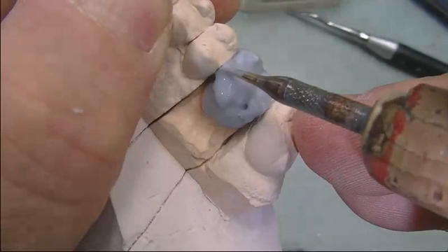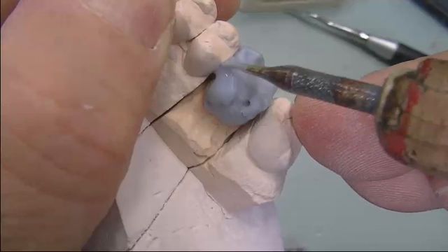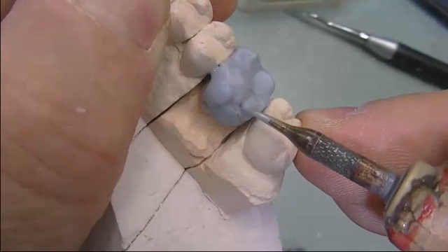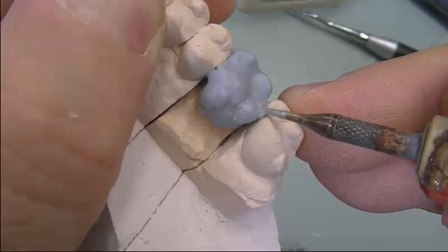Continue to fill in. Now we are filling in on the lingual surface, filling in the proximal area. As mentioned, it is a big molar, so we have a lot of wax to add.